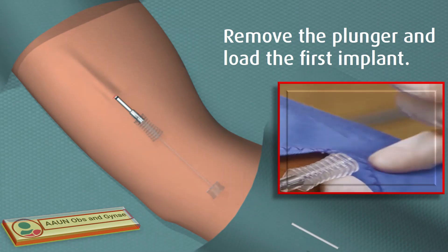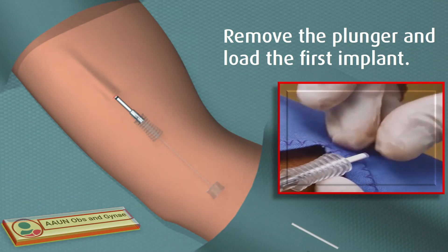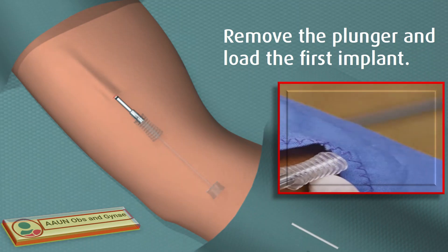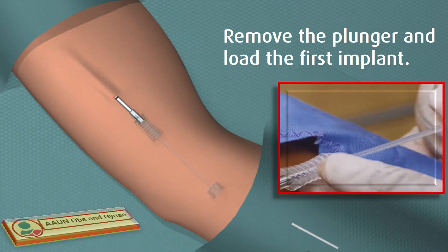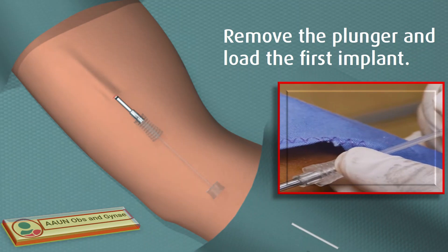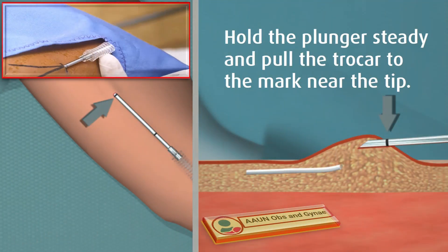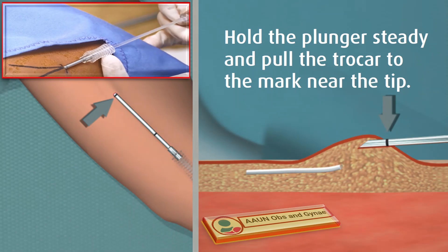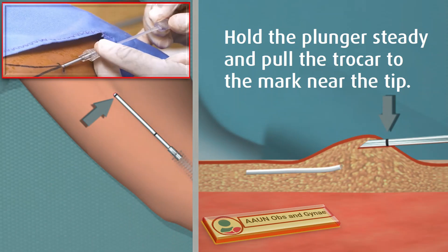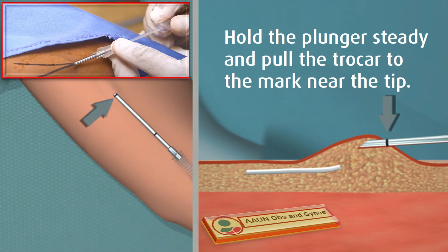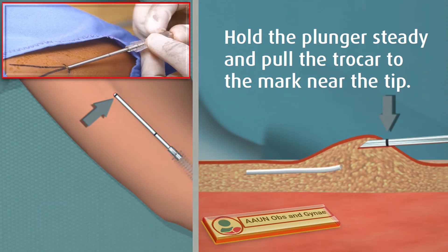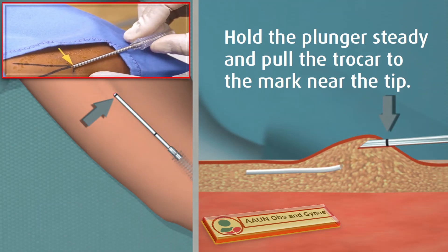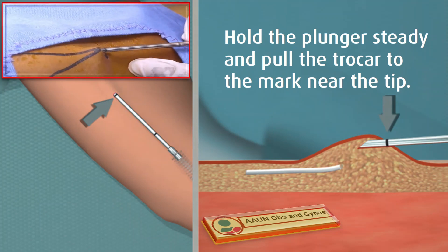Load the first implant into the trocar either with tweezers or with your fingers. Push the implant gently with the plunger to the tip of the trocar until you feel resistance, and never force the plunger. Hold the plunger steady and pull the trocar back until it touches the handle of the plunger. It is important to keep the plunger steady and not push the implant into the tissue. Do not completely remove the trocar — it is withdrawn only to the mark closest to its tip.